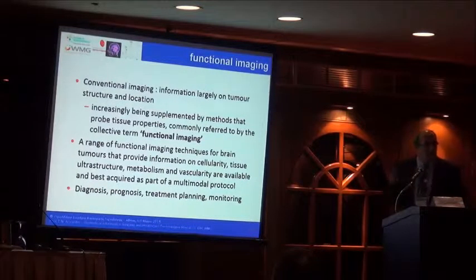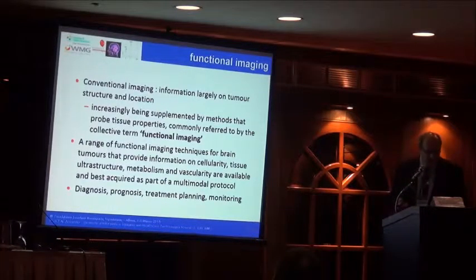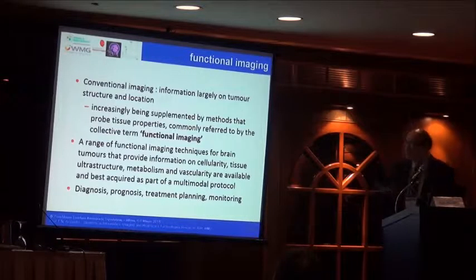Now, let me explain what we mean by functional imaging. It's not what people sometimes ask me, well, you do what the psychologists do, functional MRI. No, it's not that. Actually, it is a set of methods that allow us to understand better the tissue properties. Things like cellularity or ultrastructure, metabolism, vascularity.